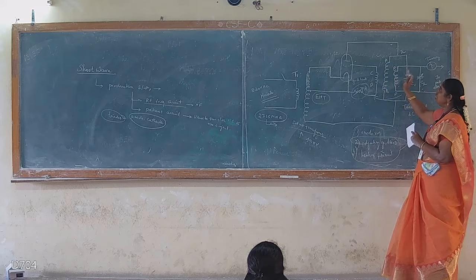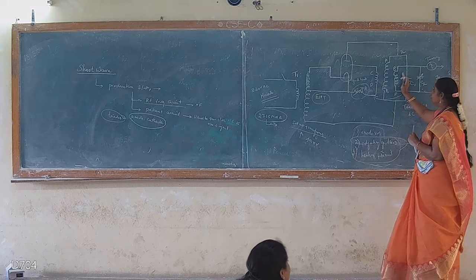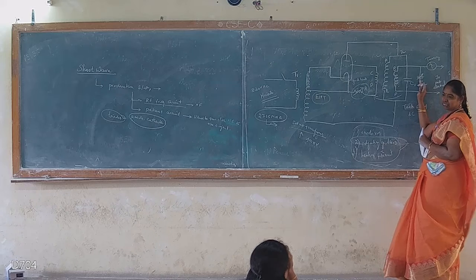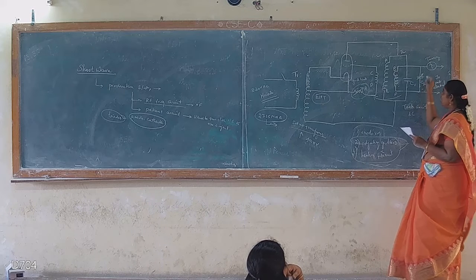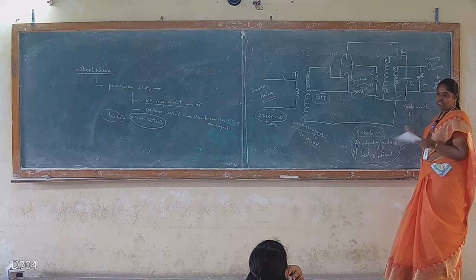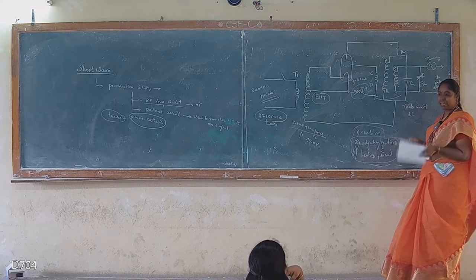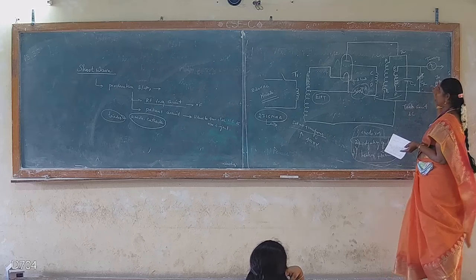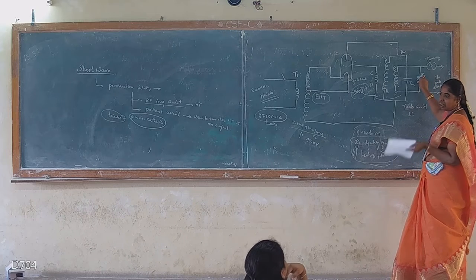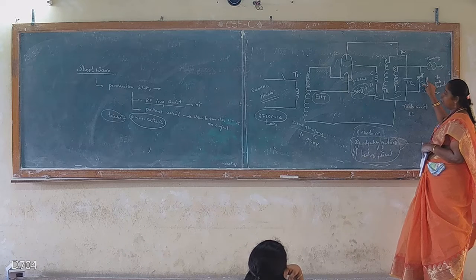The voltage produced by the LC circuit is now transferred here, and it can be applied to the subject via the capacitor. The reason a change in capacitance is required is that the amount of heat to be applied to the subject depends on the area to be treated. So according to the area, the amount of heat has to be controlled, and that can also be done by adjusting the capacitor.